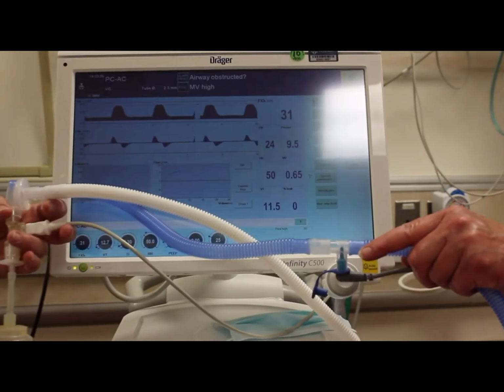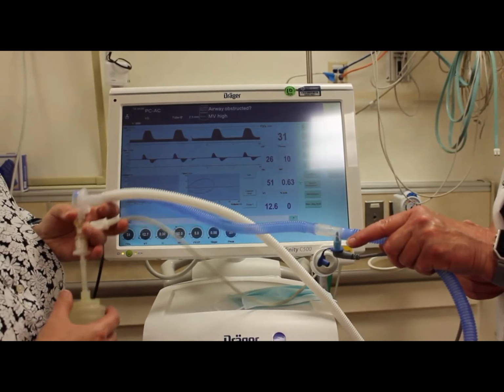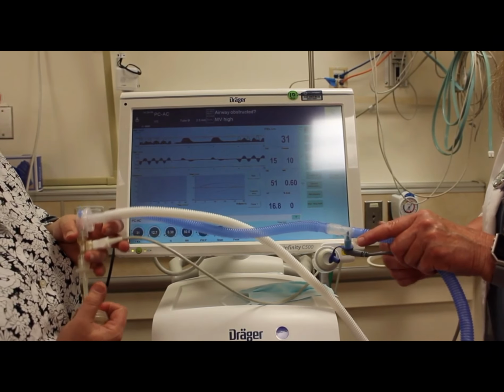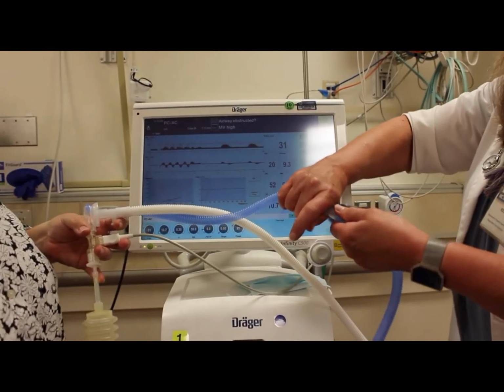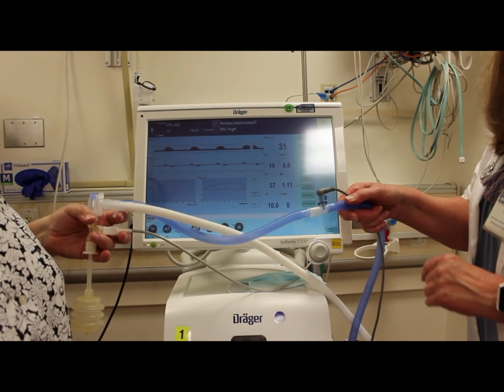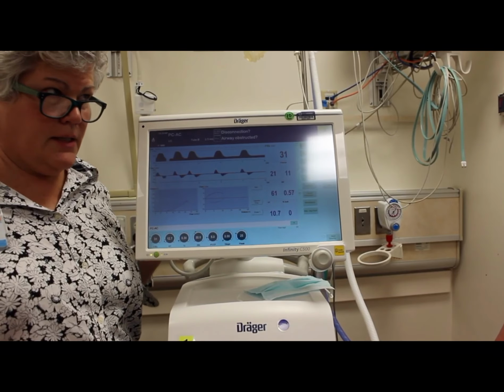The more it heats up, the more humidity you're going to get, and it's going to end up going to your baby. And then the machine thinks the baby's breathing fast, and the baby gets 100 breaths a minute when he only needs 50. Correct. Okay. So whenever you reposition your baby in the bed, when you're done, you should turn this so that it is pointing down.